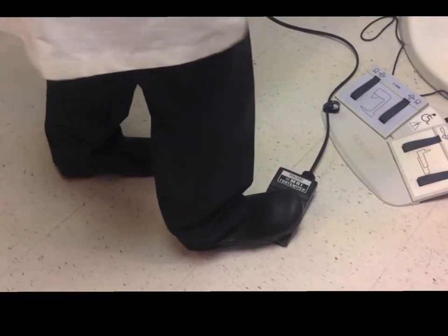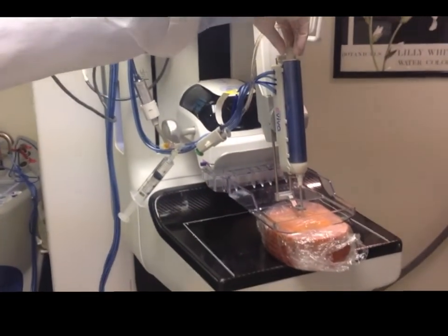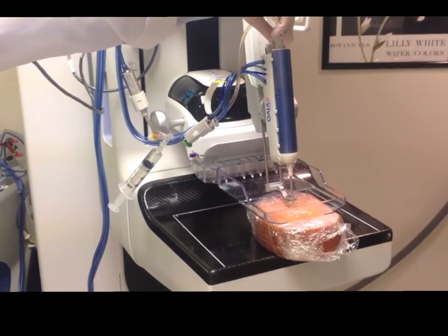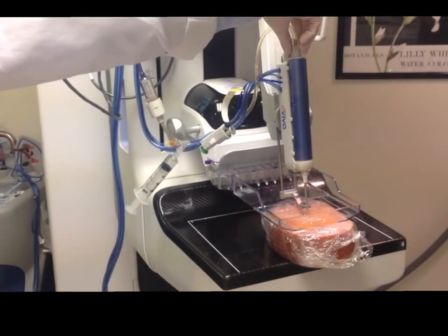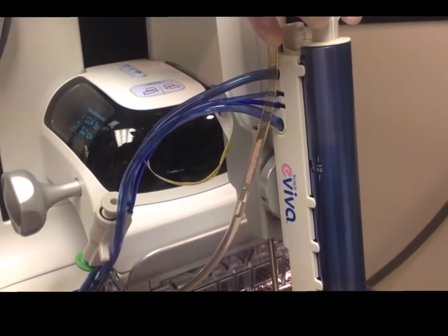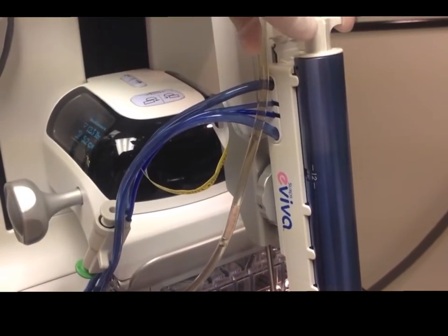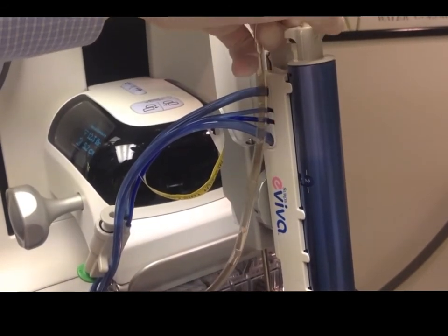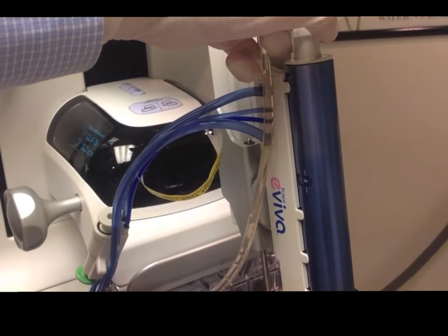We're now ready to start biopsying. Depress your foot on the foot pedal. Usually tell the patients that there's going to be a loud whirring noise, sound similar to a dental drill. Every time the machine beeps, it is taking a biopsy and you turn the back of the needle device through a two o'clock position. We usually take six biopsies initially and then radiograph them. So it's starting here at 12, beep, move to two o'clock, beep, four o'clock and so on until you've gone all the way around. At that point, you switch the machine into lavage mode.